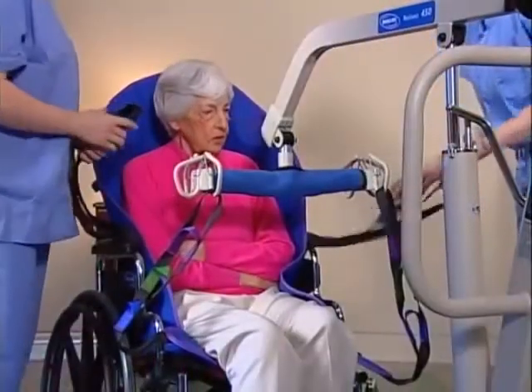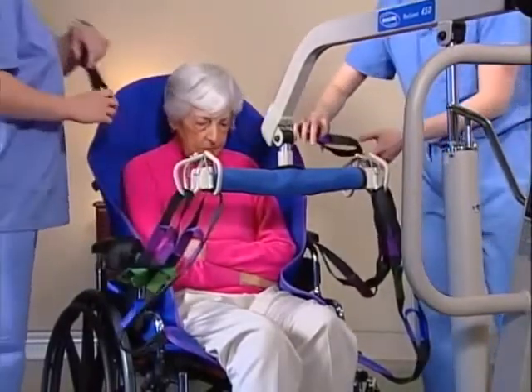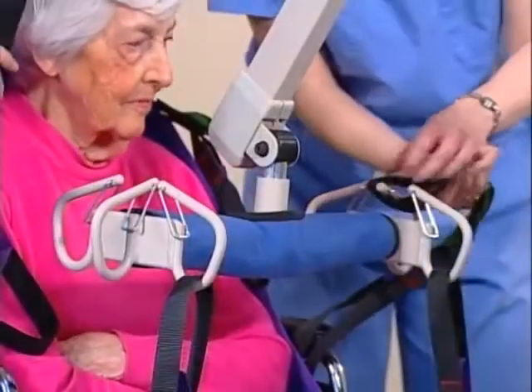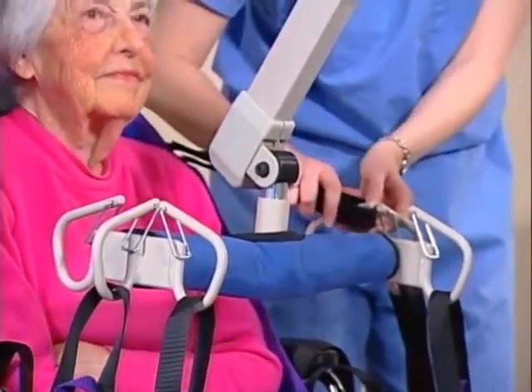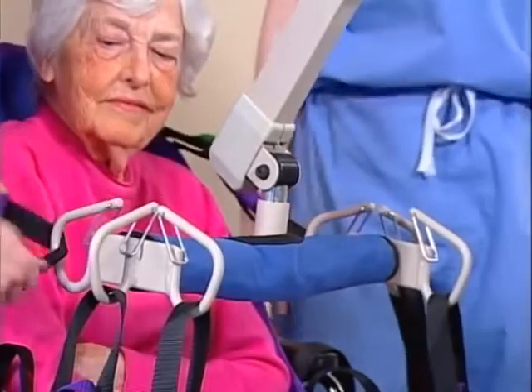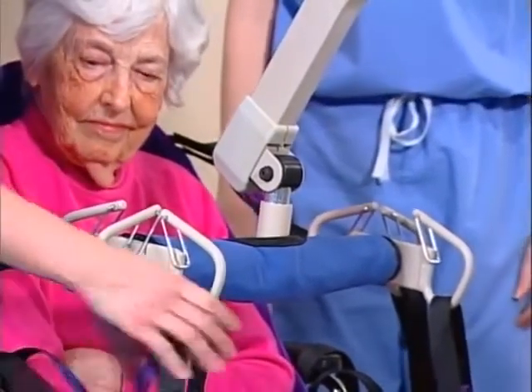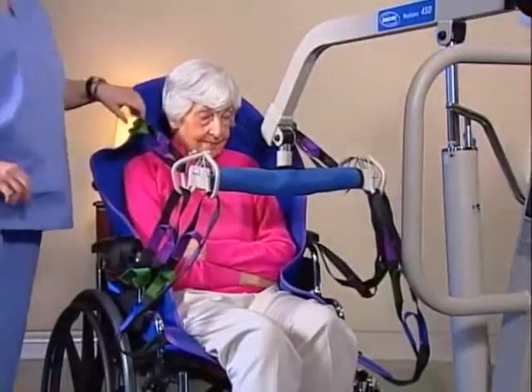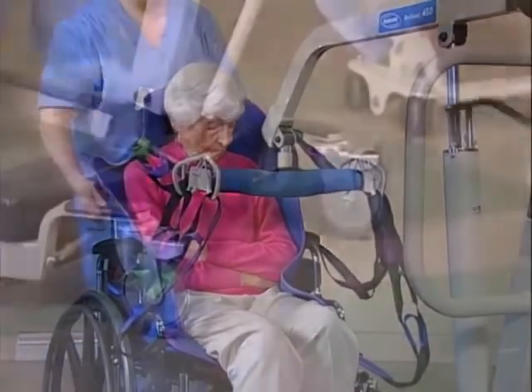Next, attach the center straps to the swivel bar using a loop that leaves a little slack in the strap. Use the same color loop on both sides. Securely attach the top straps to the swivel bar. Again, make sure you use the same color straps for both sides. Make sure the resident's arms are inside the sling.